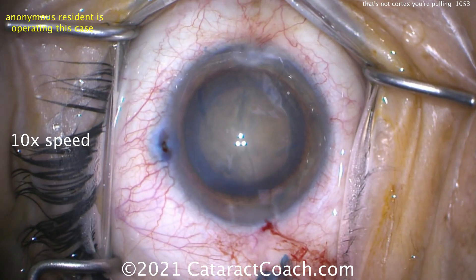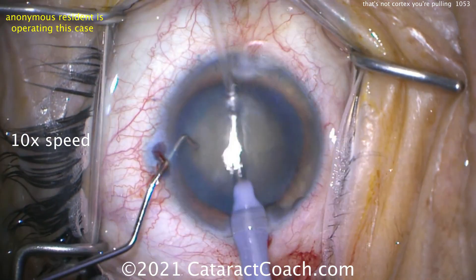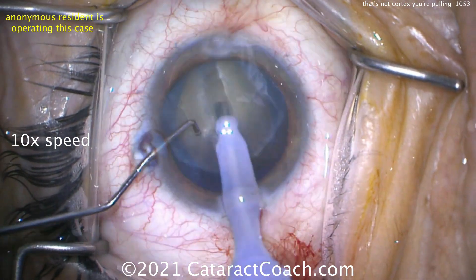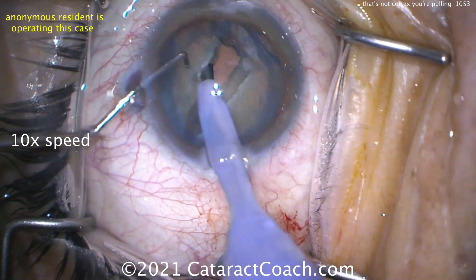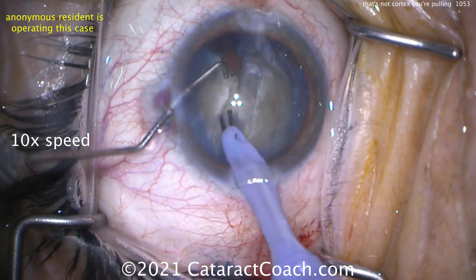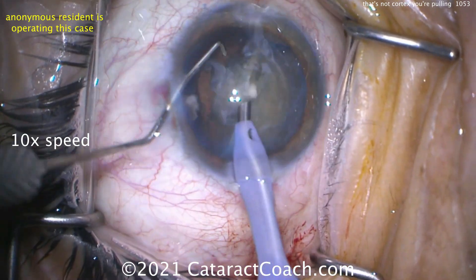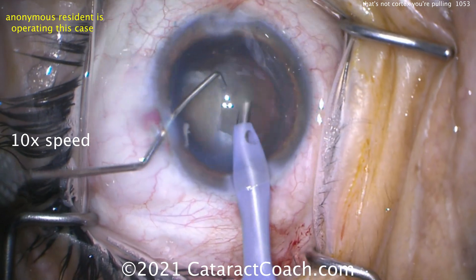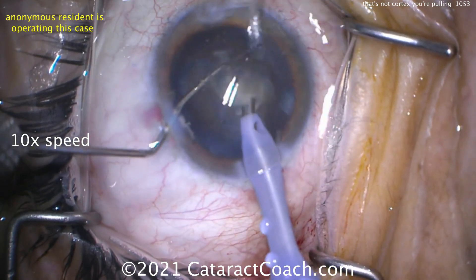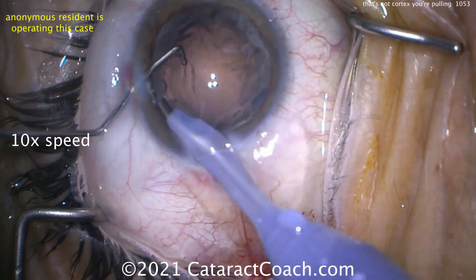A little hydrodissection here. Let's see the technique — phaco probe going in, looks like a groove down the middle. Let's see the split of the nucleus, very nicely done. A very good stop-and-chop technique — that is excellent, really quite excellent. Let's see the second half: bringing it up, chopping it and chopping it again. That was done quite beautifully. This is a very talented resident. Congratulations.